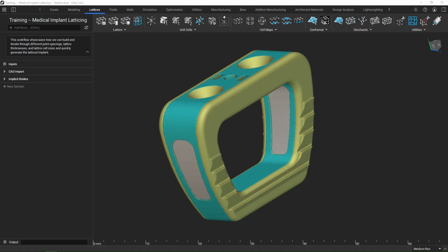Today we're going to be looking at medical implant latticing. And so for this workflow here, we'll cover a couple of different latticing techniques. Here we have techniques to work on both osseointegration of this medical implant and also a bit of lightweighting.